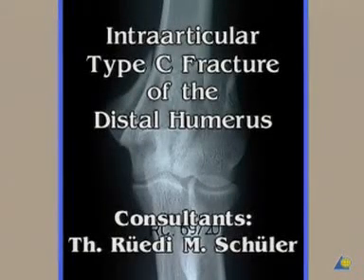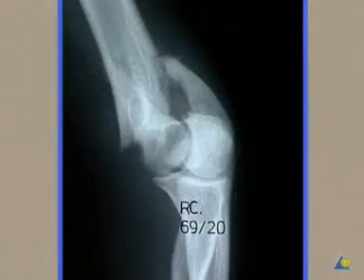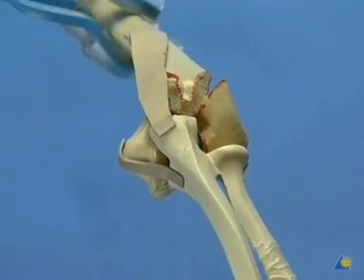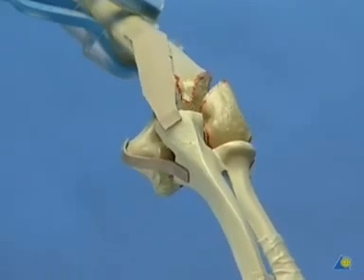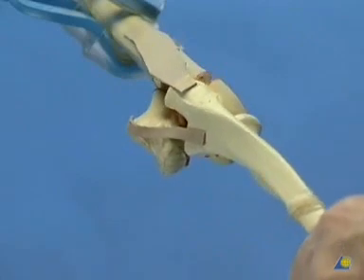Intra-articular type C fracture of the distal humerus. The type C fracture as it may present itself on the initial X-ray. By gentle traction on the flexed forearm, the fragments reduce themselves by ligamentotaxis. It may be advisable to take new X-rays under traction.